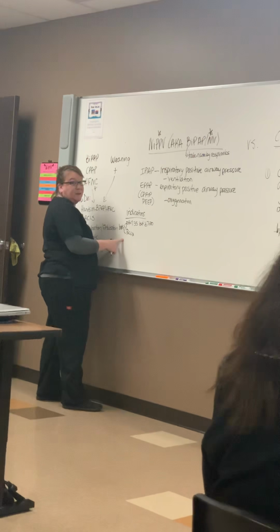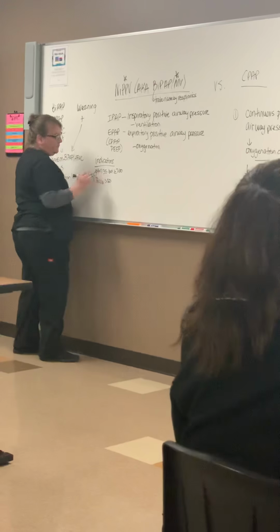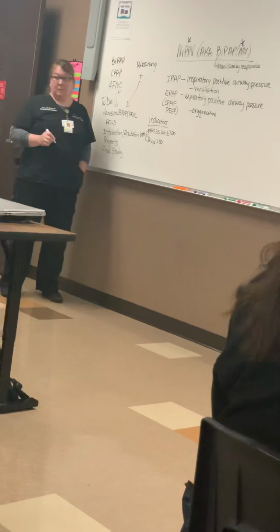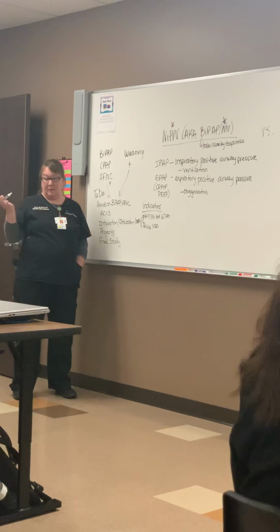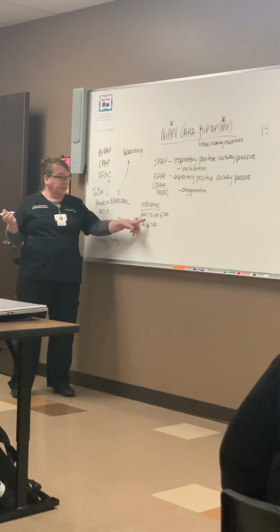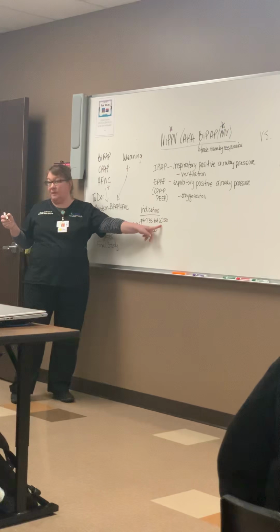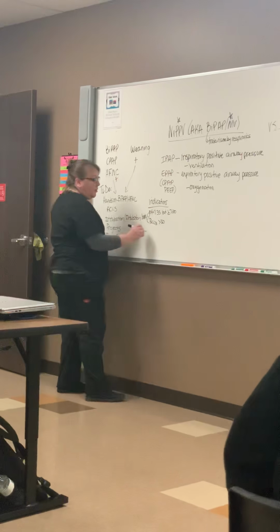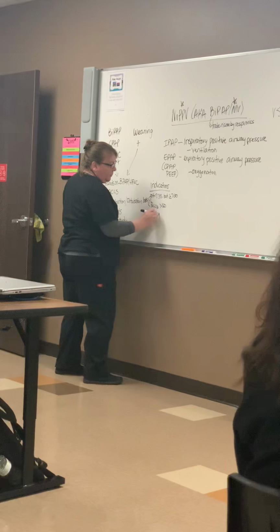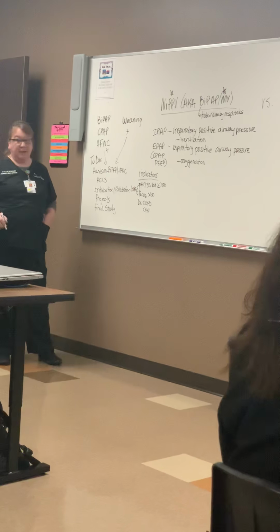So this is one time you're going to want to see the two together. So CO2 probably greater than 50. If my pH is in the normal range, your patient's compensated. They really don't need a BiPAP. So less than 7.35, but greater than or equal to 7.2, because if we get less than 7.2, what are we doing? Intubating. And then we'll just put diagnosis related. We already know this, COPD, CHF are most likely candidates.